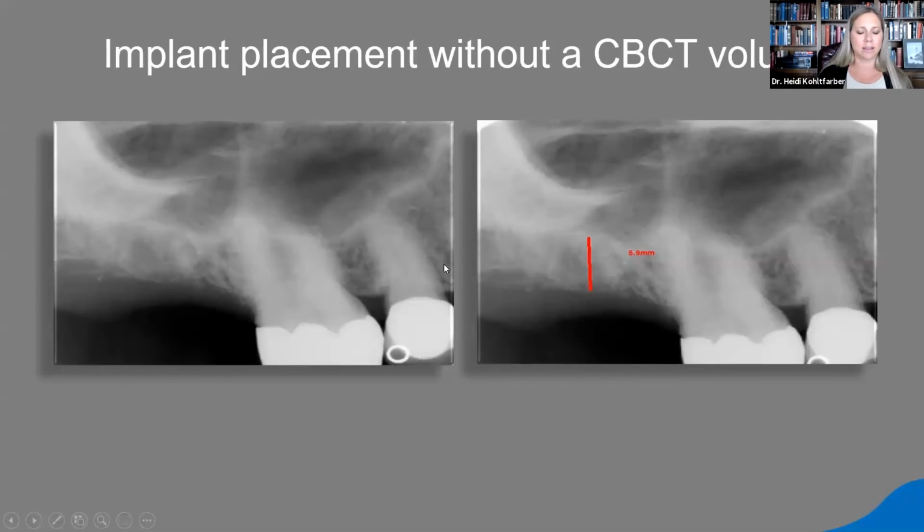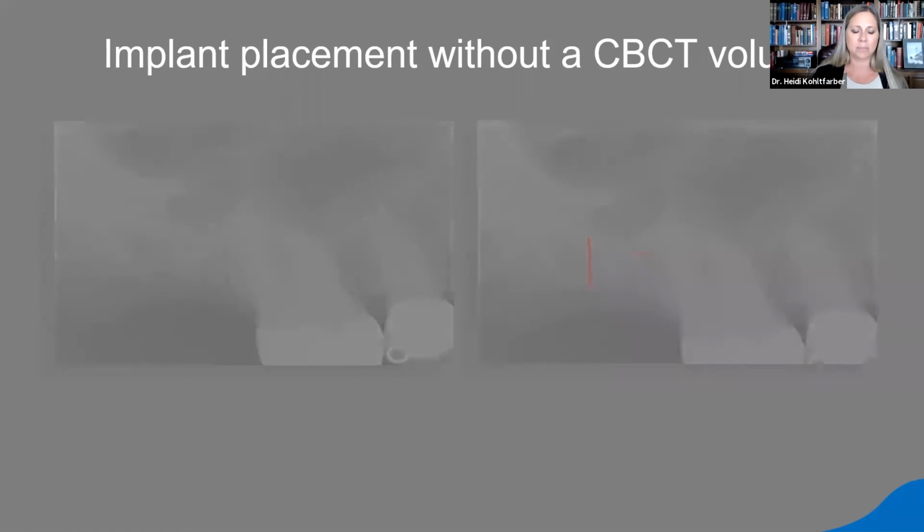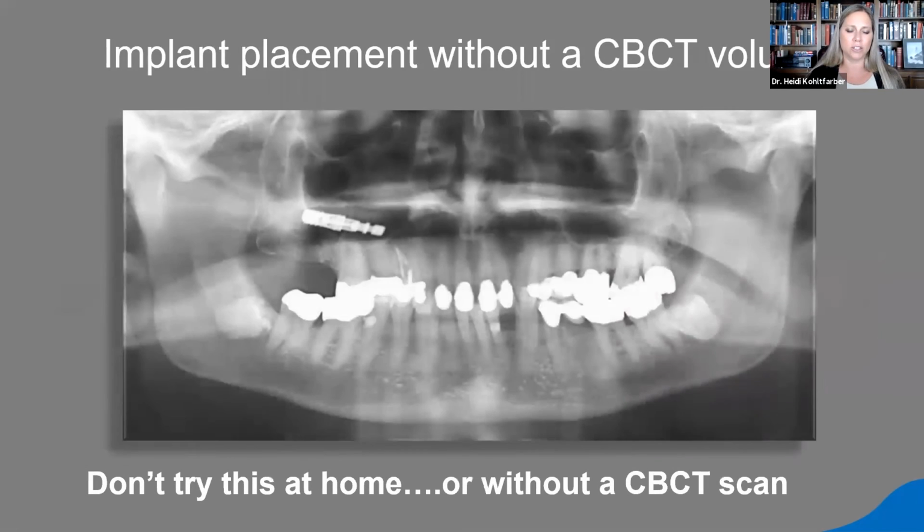So here's another example. Now, we have a wide judgment zone. We know, we've been there. We know people have bad days. This was an excellent clinician, and he's placed thousands of implants throughout his lifetime. But you can see that he made a mistake in measuring on an angled posterior maxillary PA. He then came running down to radiology with the comment, "I lost the implant."